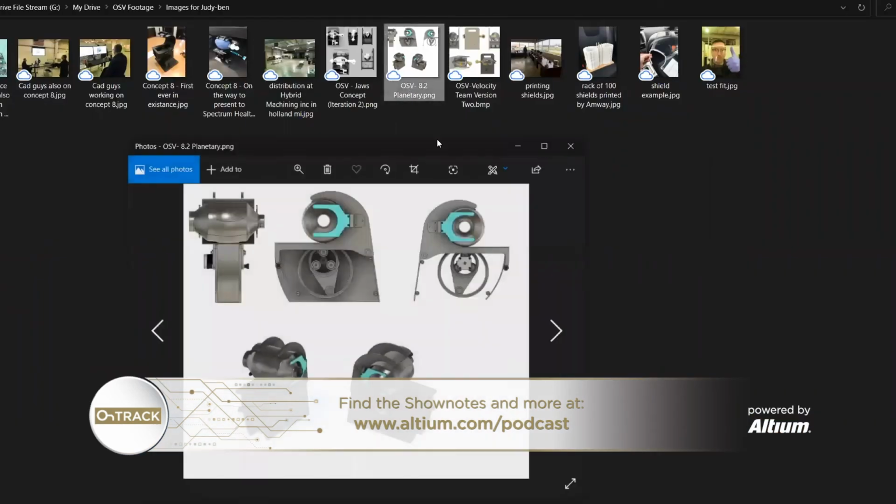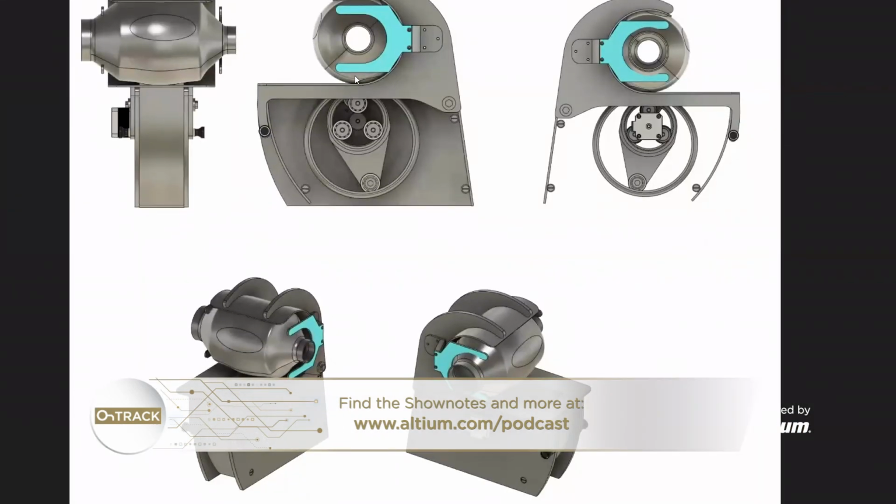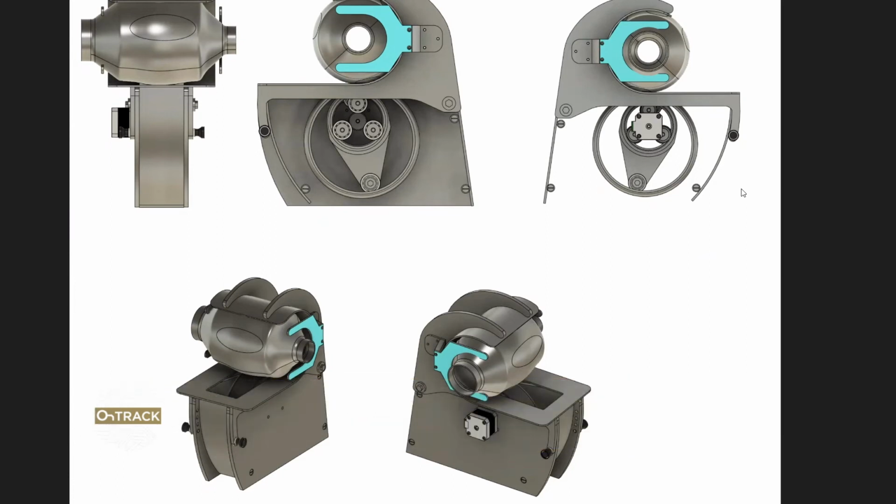So this was one of the evolutions of the design that we actually built, but the idea is that there's just the Ambu bag that's normally hand operated, but we wanted a way to actuate that, because the air circuitry for all of that and the masks already exist. So let's focus on just making something that will automate a previously manual process. And the governor of New York was actually talking about bringing in the National Guard to manually actuate these with humans. This is a really good solution for that kind of problem. Okay.